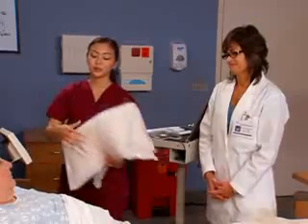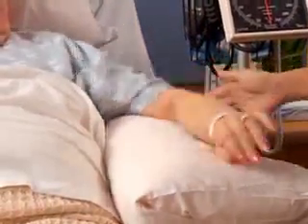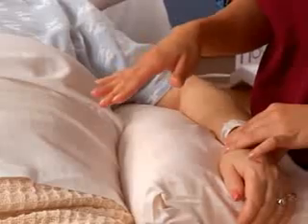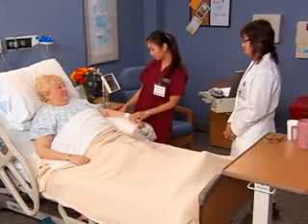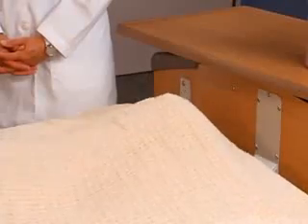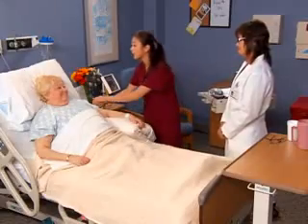Okay, I just want you to get comfortable and put your arm like so. Good. How's that feel? Fine. Okay, I'm putting her arm on the pillow to make sure her forearm is supported at the level of her heart. Your back's supported. Good. Are your legs crossed? At the ankles they are. I always do that, but I can uncross them. Thank you. Now I'm going to slide up your sleeve so I can wrap this cuff around your arm.